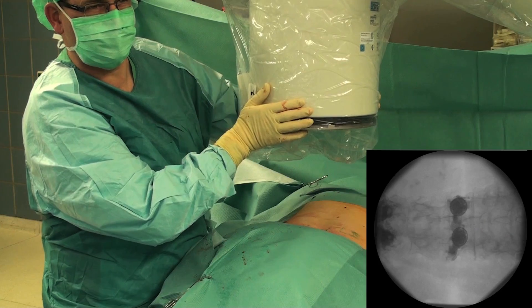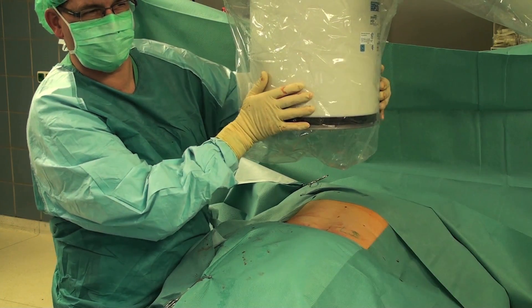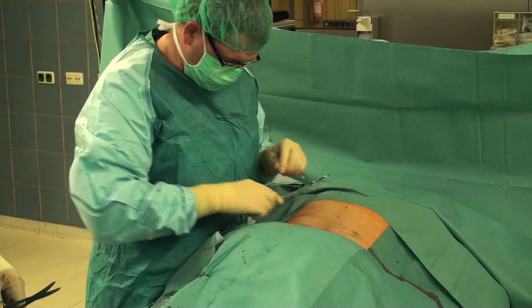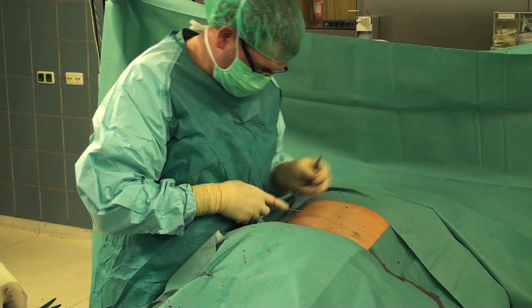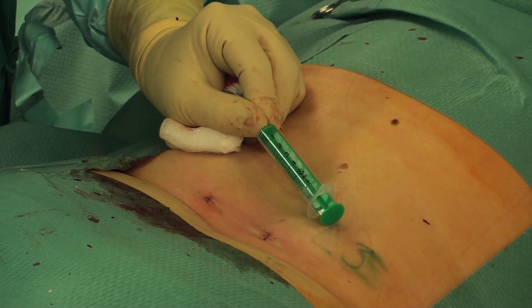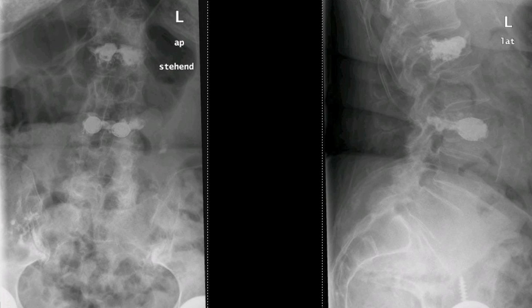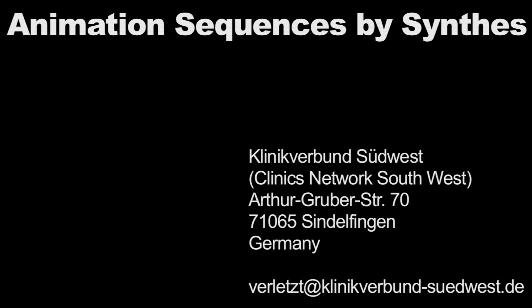The final AP and lateral X-ray show a good and significant restoration of the vertebral body height. The skin suture is performed with biodegradable suture and infiltration of local anesthesia as the final surgical steps. The skin incisions are no bigger than 0.5 cm. In the post-operative X-ray you can see the situation after kyphoplasty in L1 and after vertebral body stenting in L3. In the last 12 months we have successfully treated 75 patients with this new method, achieving good and significant height restoration and pain relief in all cases.